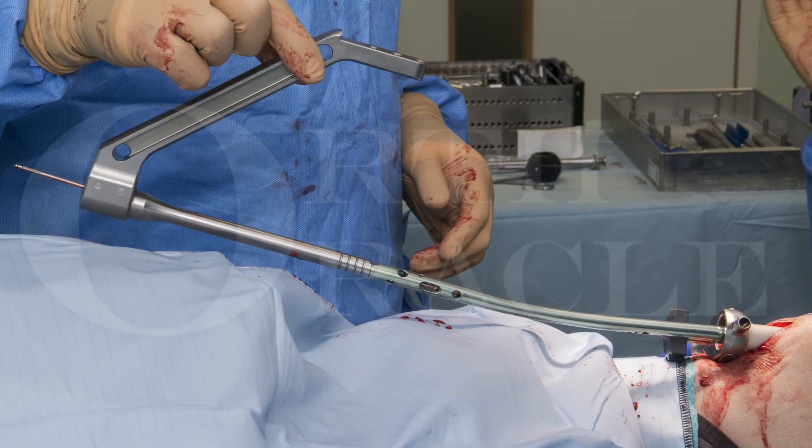On completion of reaming the nail is inserted. This should be as atraumatic as possible and involve only gentle use of the hammer. If the nail won't advance there's usually a reason other than insufficient force and this needs to be identified. Often the nail needs to be carefully guided past the cortex, and occasionally it will be necessary to ream to a slightly larger size. At times the nail will get stuck on the blocking wire in the distal segment and this may need to be repositioned or a second wire placed in a new position to allow the nail to pass.